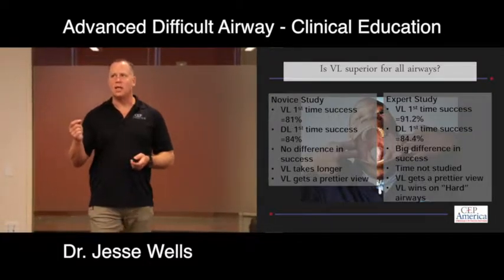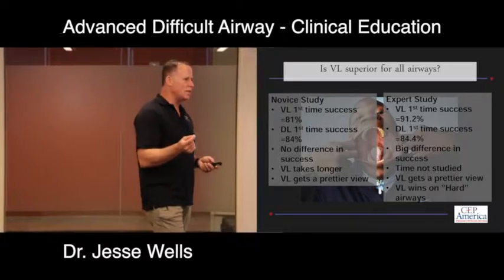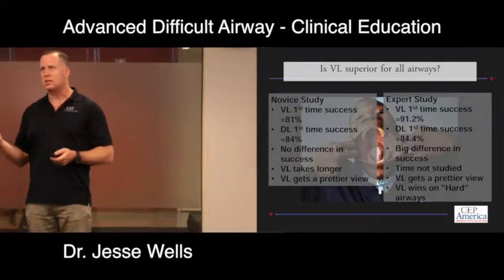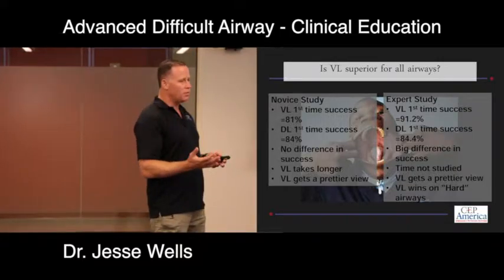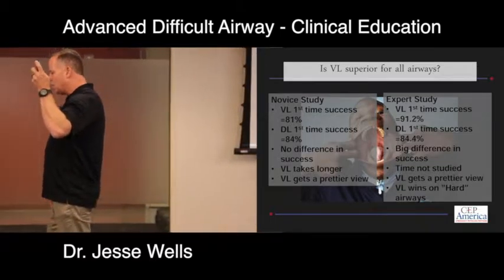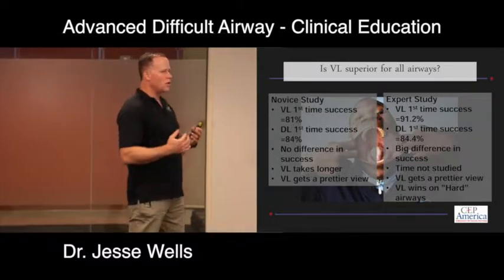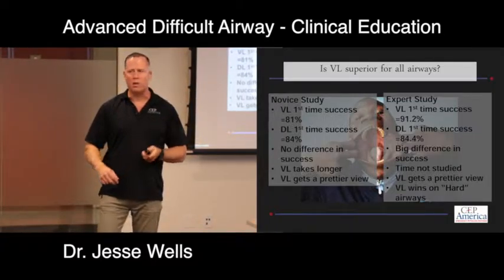So in the novice study with video, they were only 81% successful with their first pass versus 84% with direct laryngoscopy. So they were better with direct laryngoscopy, but it wasn't statistically significant. It took a lot longer for video, but video gave them a better view, but really that's not very important to us. So when they couldn't get the tube with video, what did the novice group use as their rescue airway or the rescue technique? So they couldn't get it with a video, what did they go to? DL, right. They tossed it, went to DL, and got it.